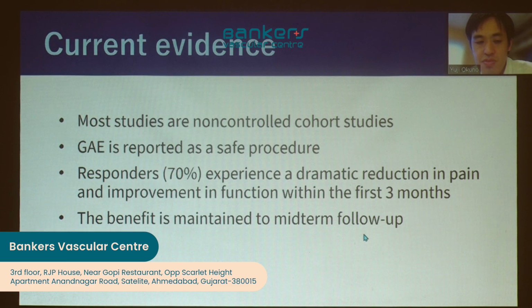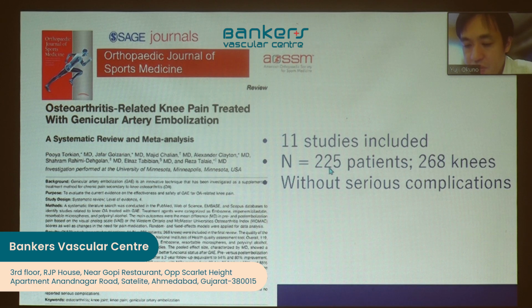This procedure is widely performed in the United States and, for example, in Europe, including Germany, Spain, and France, and also in your country, India. And Dr. Banker has performed many cases of TAME. This is a meta-analysis paper of 11 studies, including more than 200 cases of GAE, and they reported the procedure is very safe.